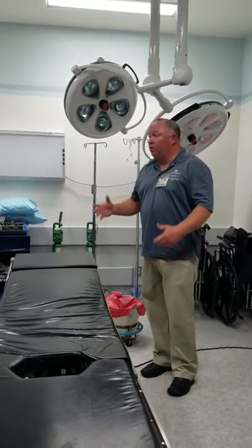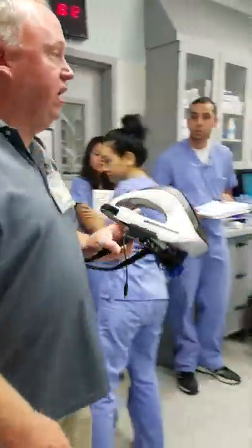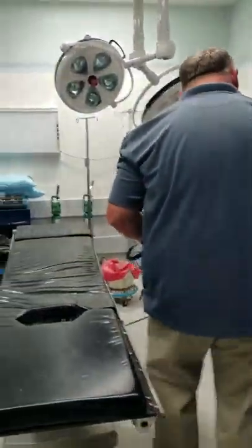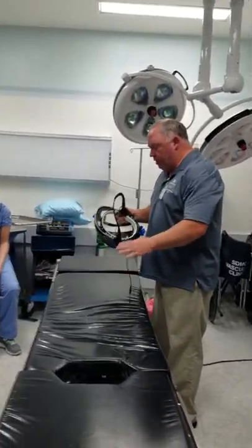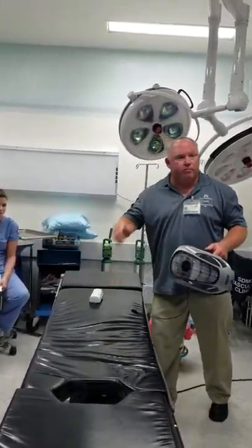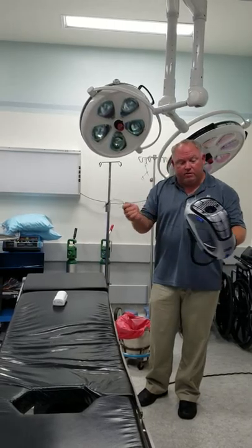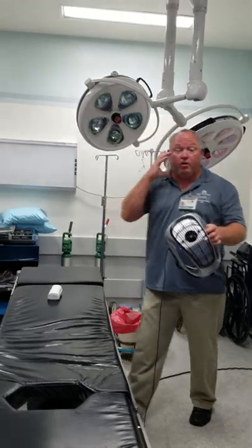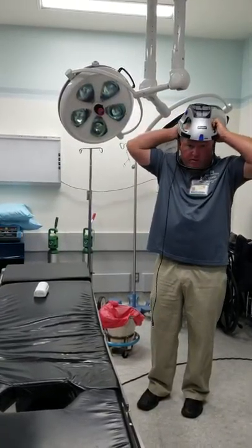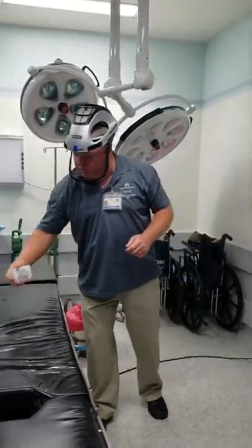Now we're scrubbing. What you've seen in that video is the helmet — that's what the helmet looks like. If you were a scrub tech scrubbing in, you do your normal scrubs, hair net, booties. You make sure you have your booties on, your mask on — this goes on top of your hair net, just for comfort. You don't want it too tight, too loose, or pulling around too much. This goes in your back pocket.